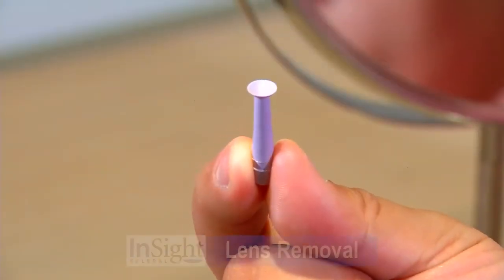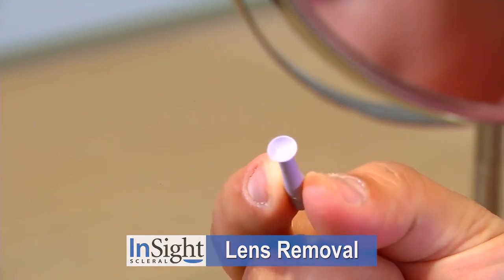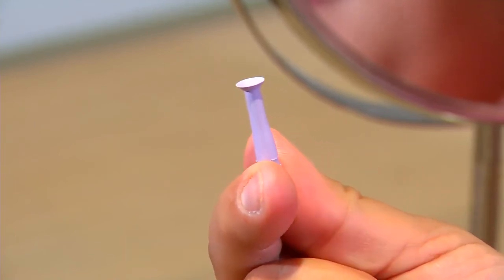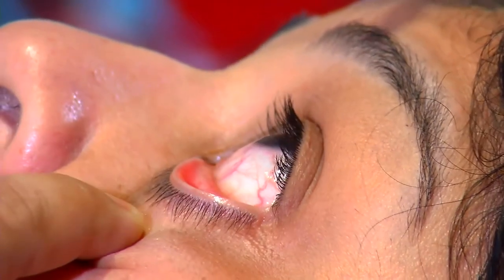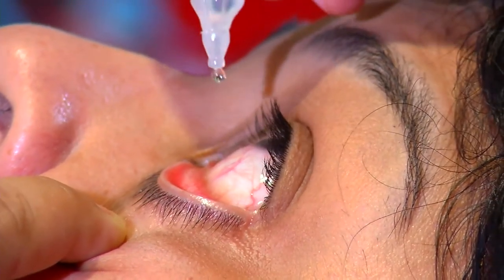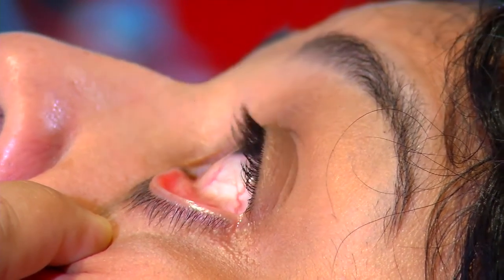Now let's move on to removing the InSight Scleral Lens. A small DMV contact lens remover is highly recommended for lens removal. Since the lens is large, the suction that holds it in place can be quite strong. Placing several drops of non-preserved saline in the eye before trying to remove the lens can be a big help.